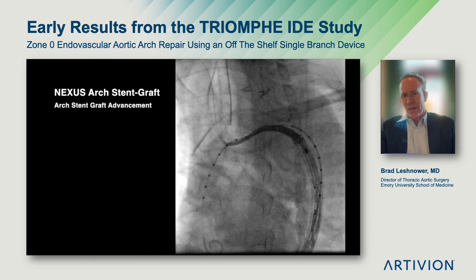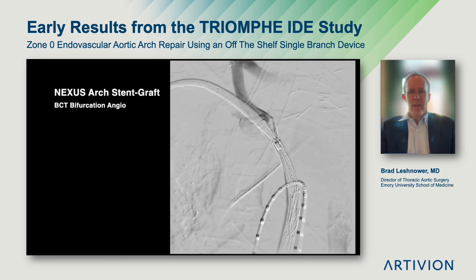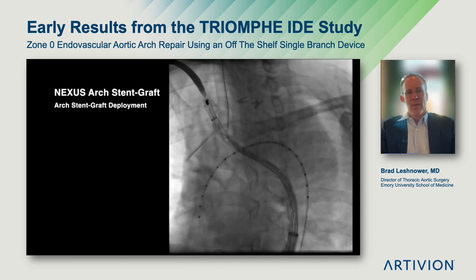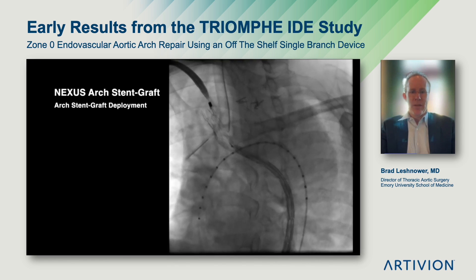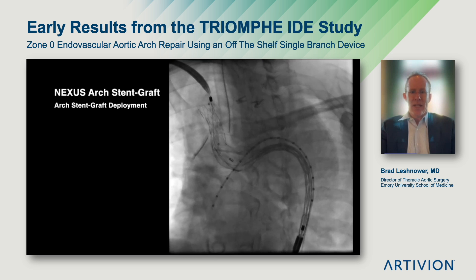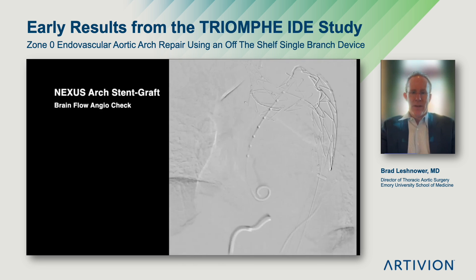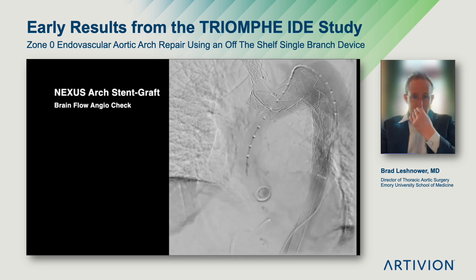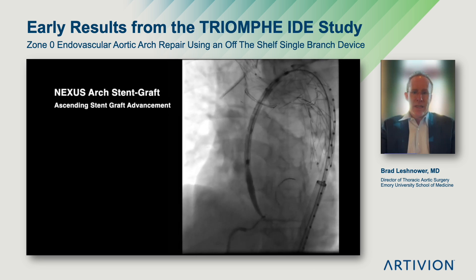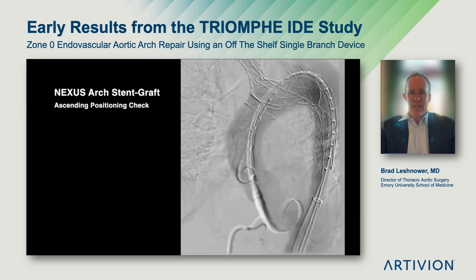Now I'll take you through the fluoroscopy and aortograms of the case. The device is advanced through a brachiofemoral wire. We then shoot an aortogram to confirm appropriate positioning. The branch is deployed, then we do a short burst of rapid ventricular pacing to position the dock in the distal ascending aorta. Once that dock is open, cerebral perfusion is established. We can take our time deploying the remainder of the arch stent graft. We then shoot an aortogram showing the branches being perfused. Next, we advance the ascending aortic piece and position it appropriately within the dock to achieve the fixation previously described.